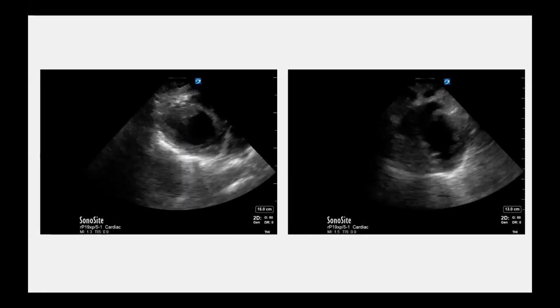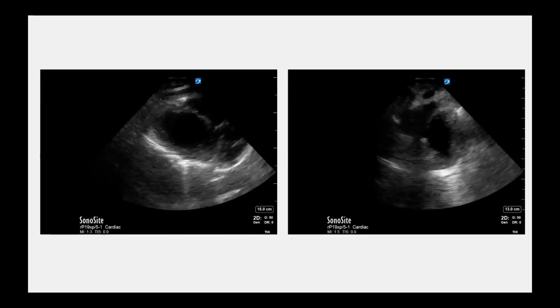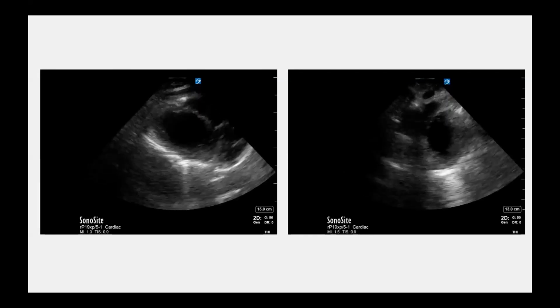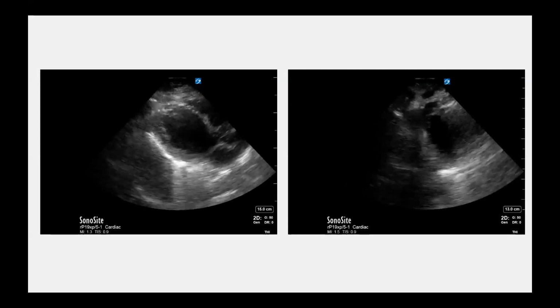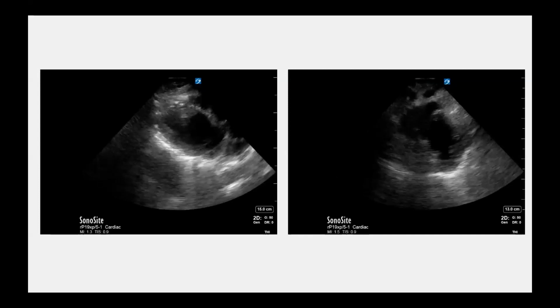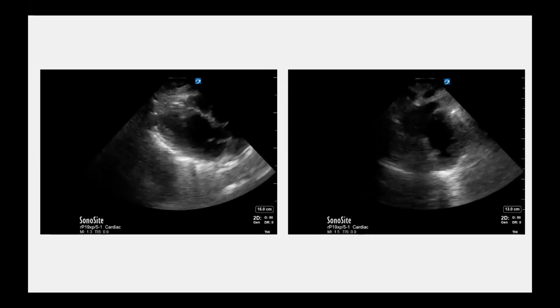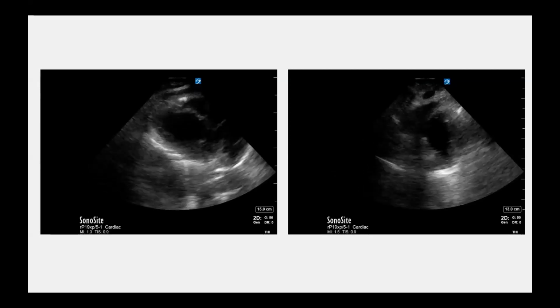What you looked at anteriorly sometimes can be confusing as well for a minor or a very tiny effusion. But if you're seeing it there and it's a simple or very small effusion, you should also see a very tiny area of anechoic free space between the DTA and the left atrium. You see it best during systole, just below the coronary sinus. That's where you look for a tiny effusion in a patient, let's say with pericarditis.